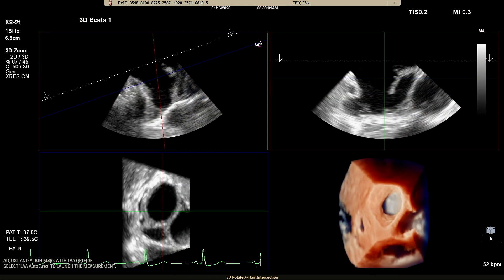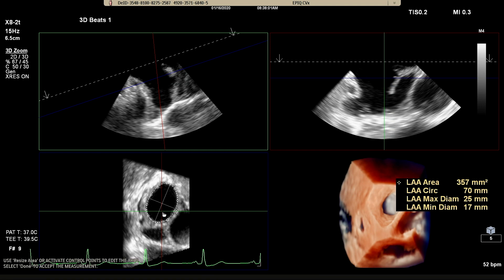With 3D Auto LAA, which can be combined with TrueView, it's quick, easy and intuitive to get confident LAA sizing.